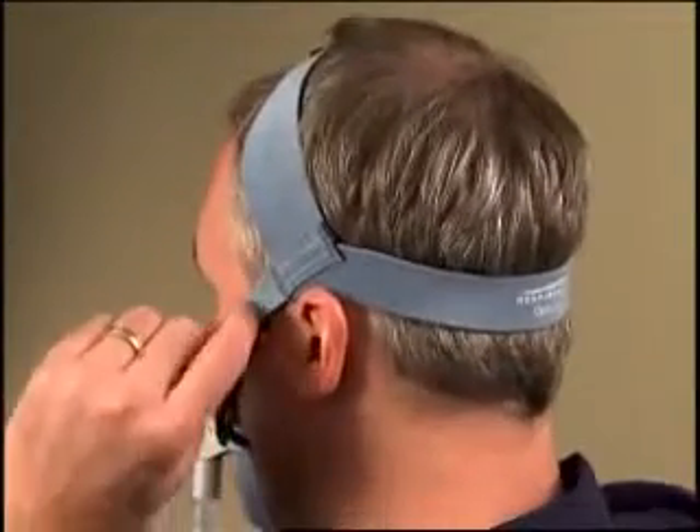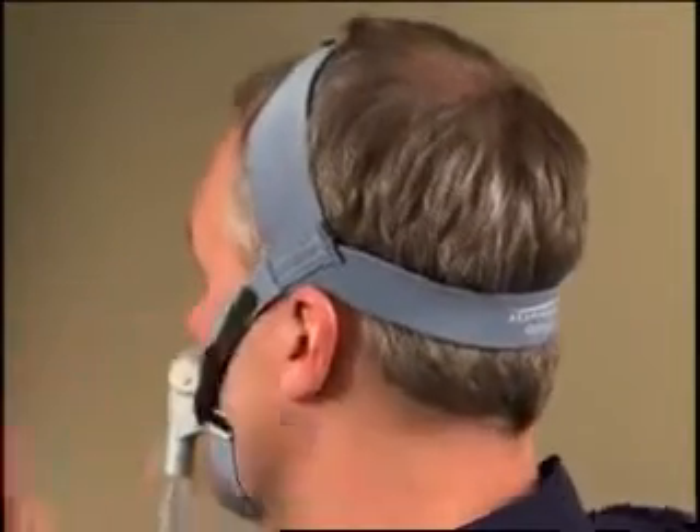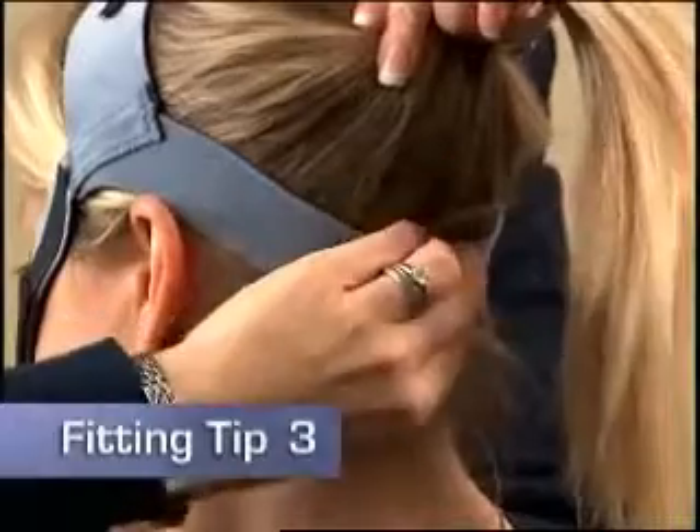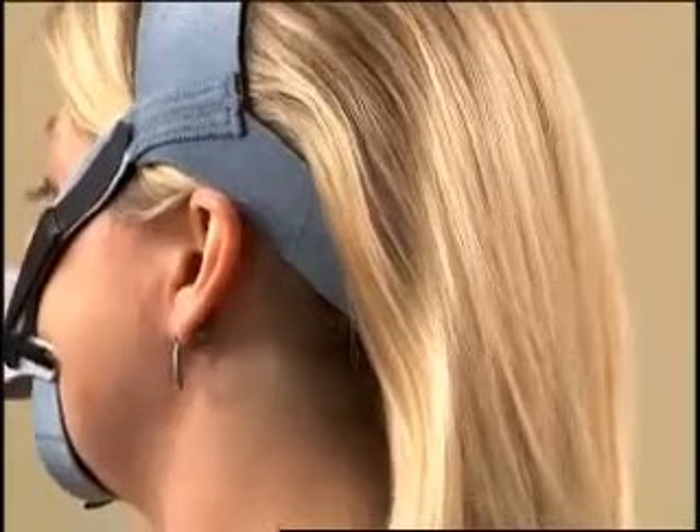Readjust the side straps and chin support band as necessary for comfort. If your hair is long and silky, hold your hair up when putting on the mask and place your hair over the back headgear strap.